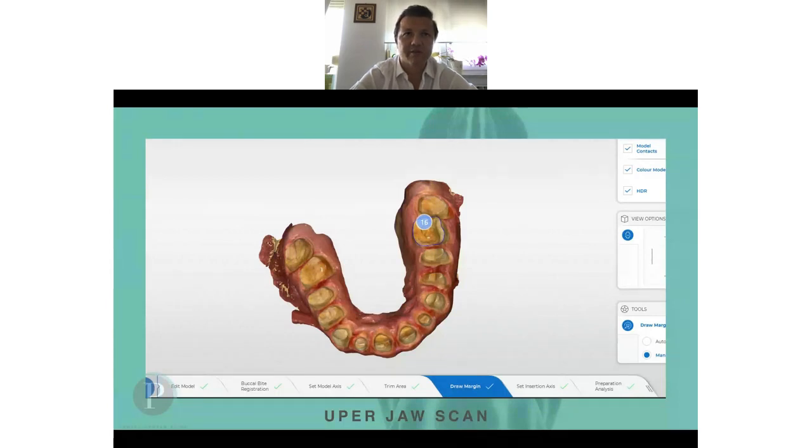It was not a dental microscope, it was a professional microscope, and I was very surprised, because I thought I had repolished the surface of the chamfer well, and I saw how it looks when you use a red burr, compared to when you finish with the green, or let's say black.